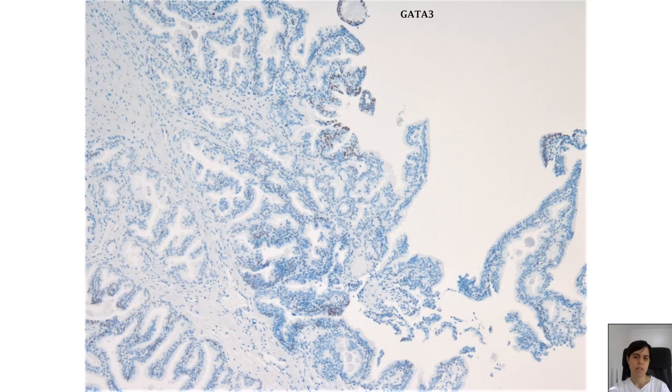And GATA-3 usually highlights some — sometimes more, sometimes less — scattered urothelial cells intermixed within the prostatic epithelium of these lesions.